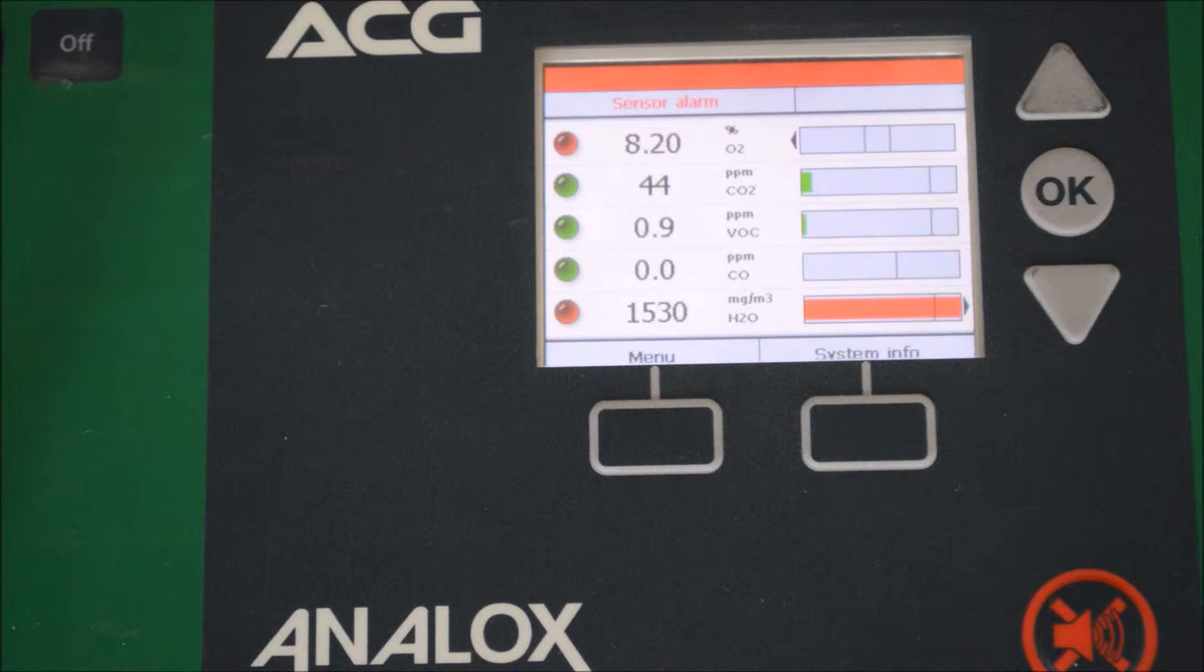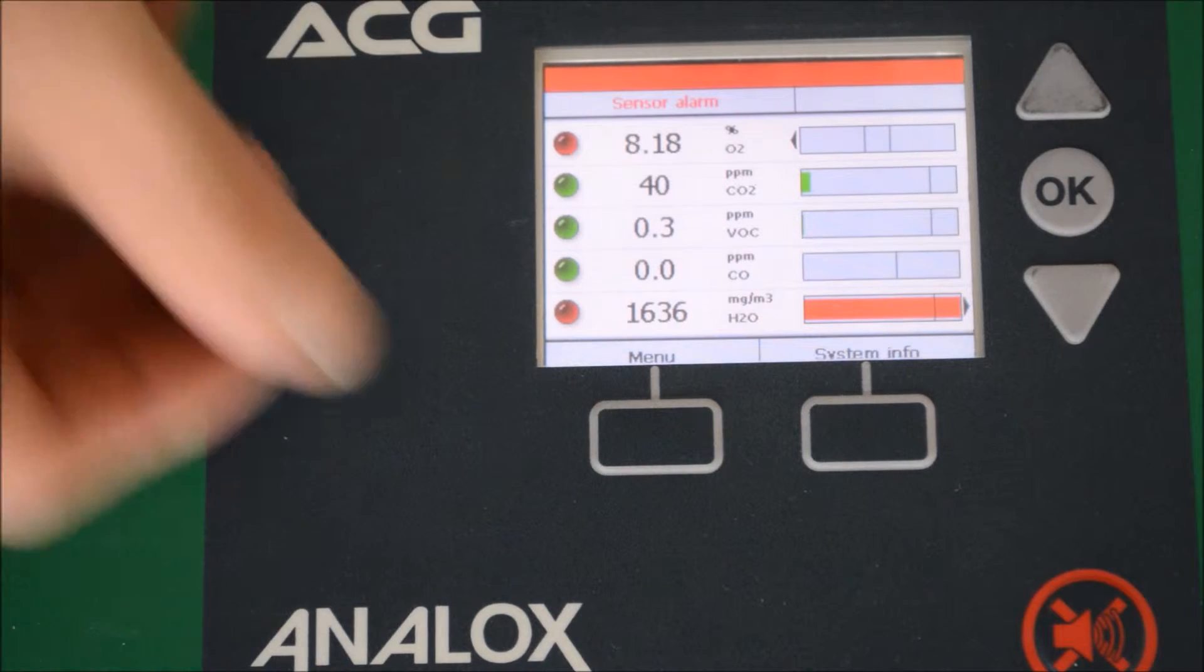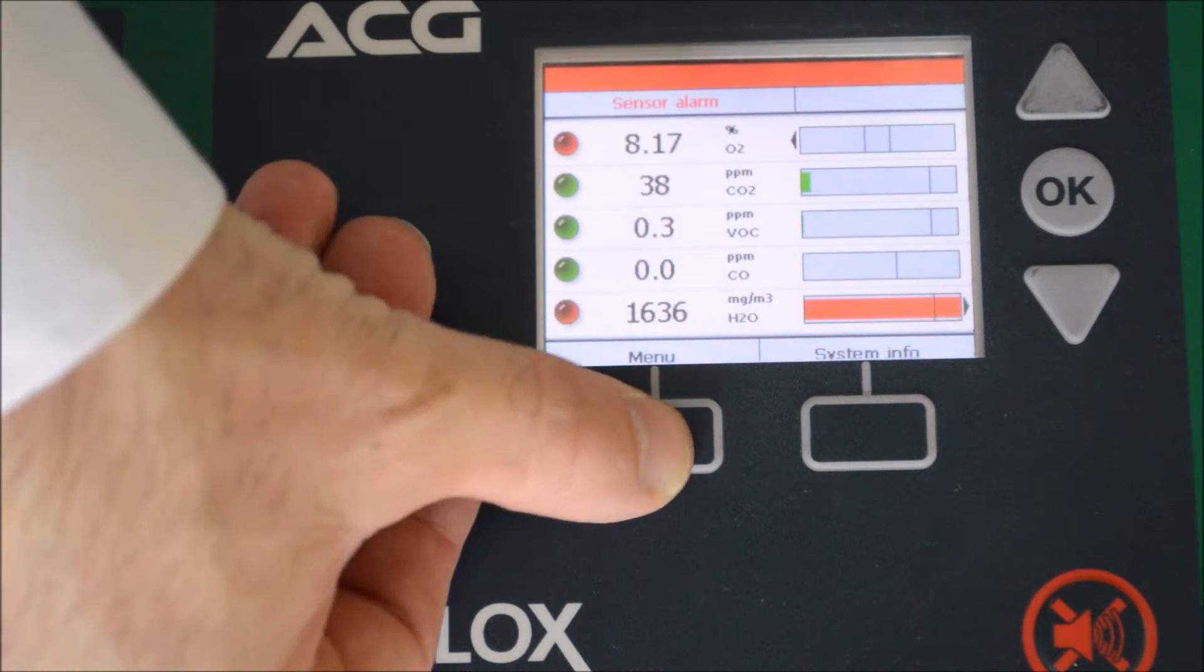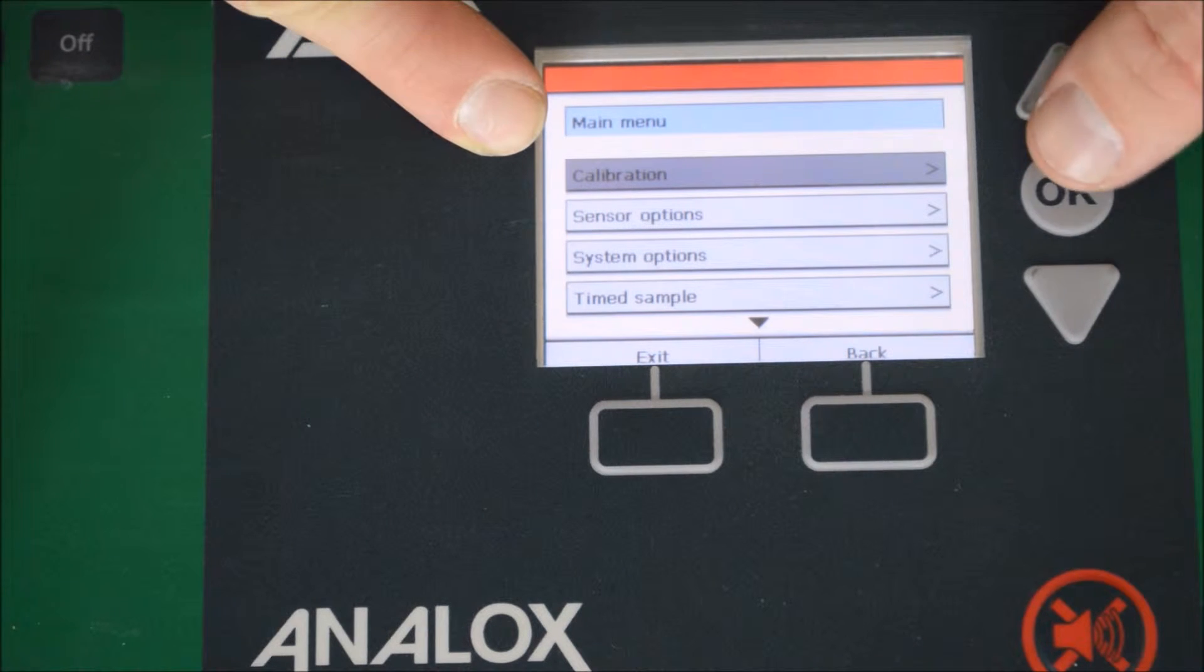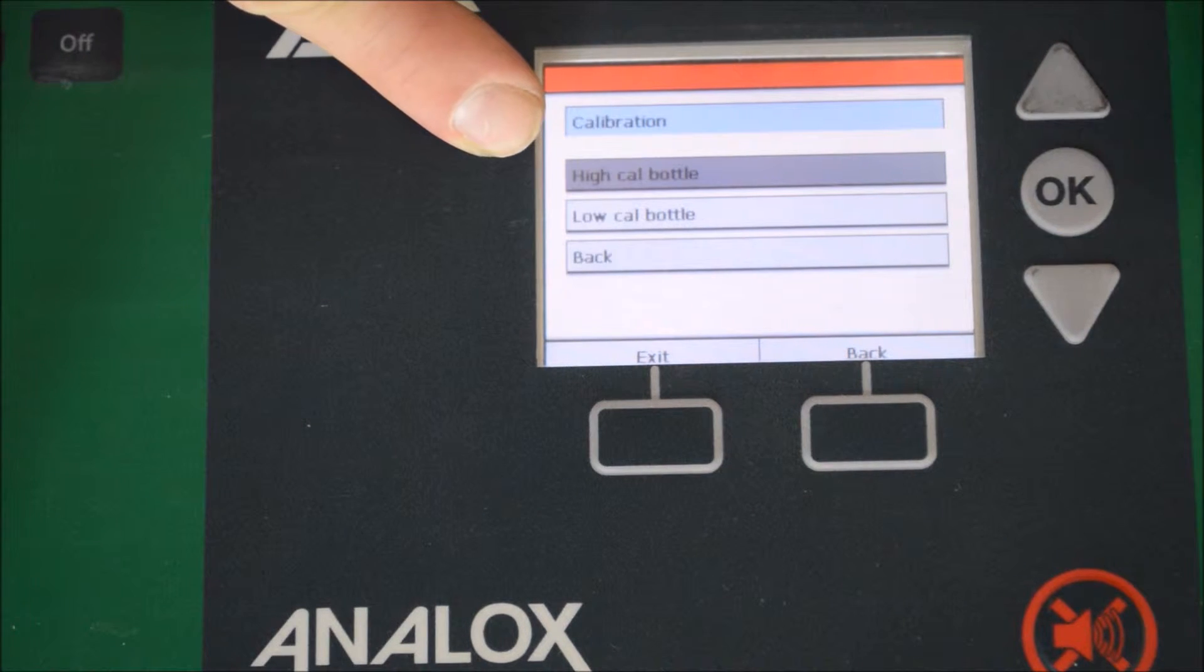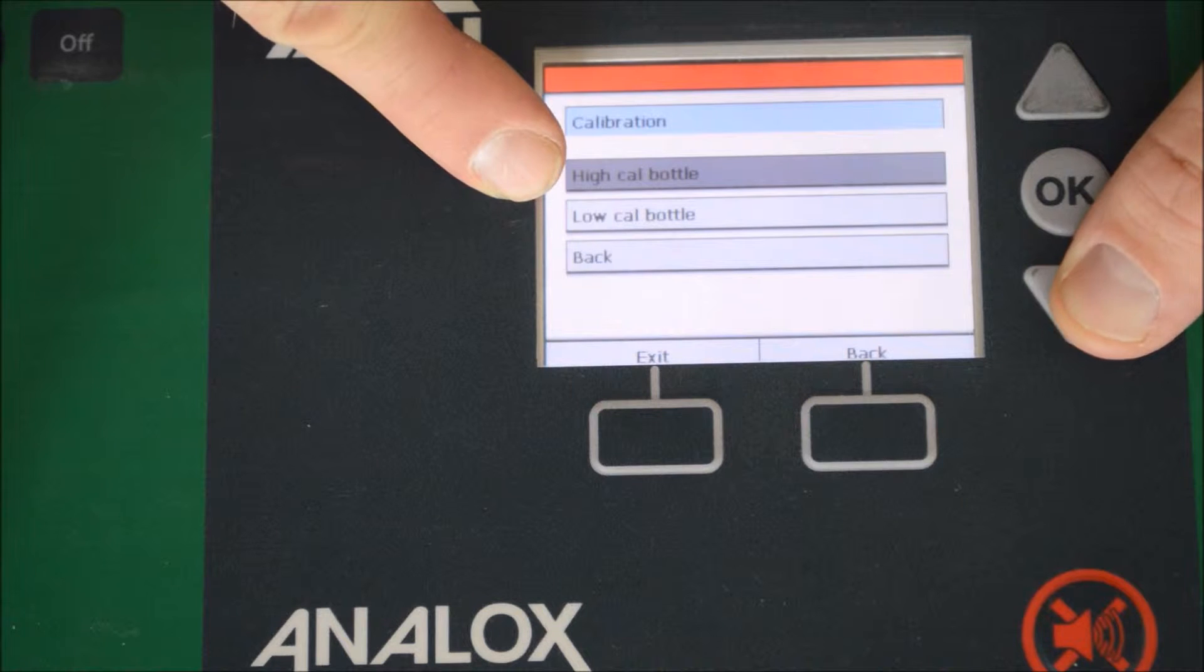We're now carrying out a zero or low calibration gas calibration. Through the menu system, we need to select menu, select calibration, which is the top one, select low calibration bottle, which is the one we've got on.